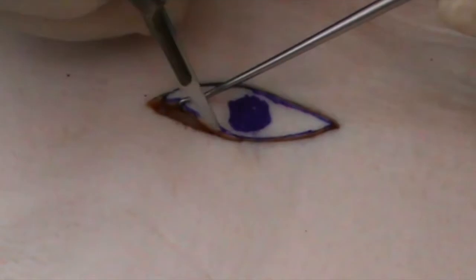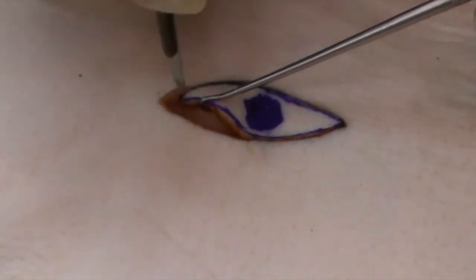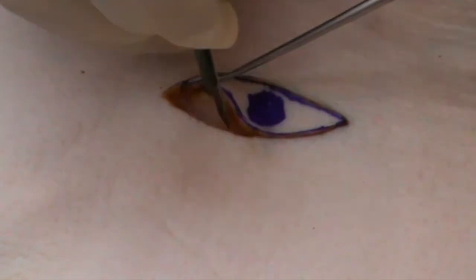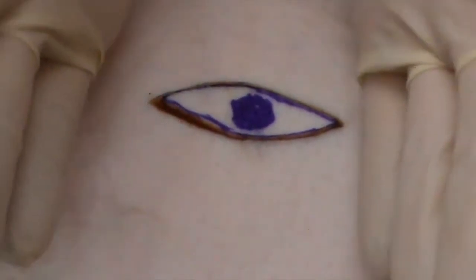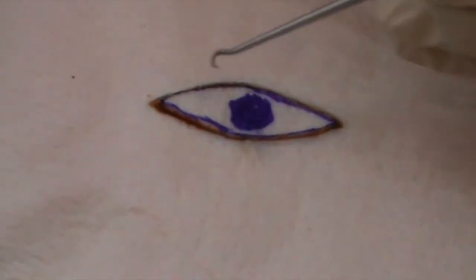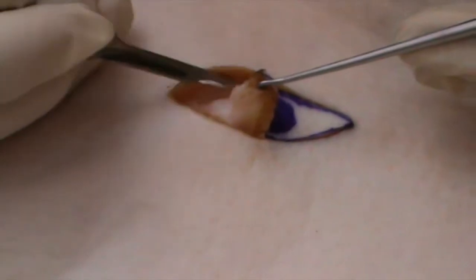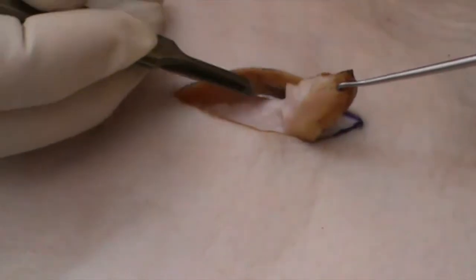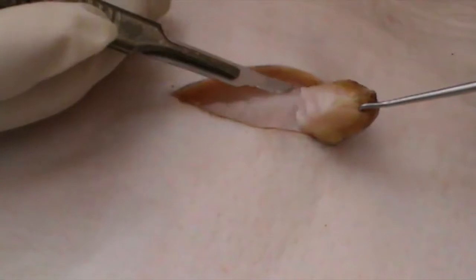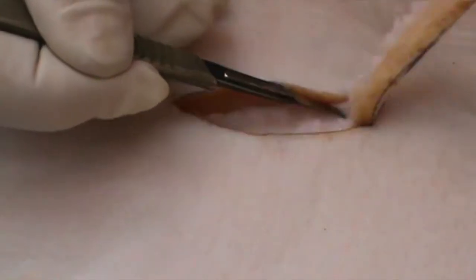Once you have cut your ellipse, it's important to cut down to the fat layer again by keeping the scalpel at 90 degrees to the skin. There's a temptation to keep on cutting at an angle and you end up with a so-called boat-hull excision. The difficulty there is you won't bring the edges together. So we've gone for a 90-degree cut down to the fat and then it's a question of gently easing the specimen off from the base — always cutting into the centre and not cutting out towards the edge, avoiding any damage to the edge of the wound.